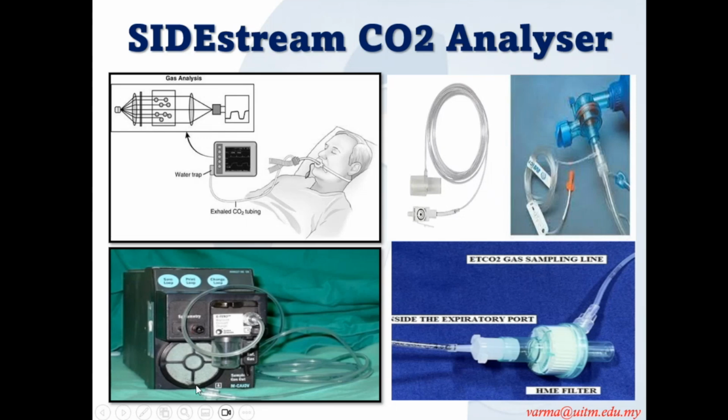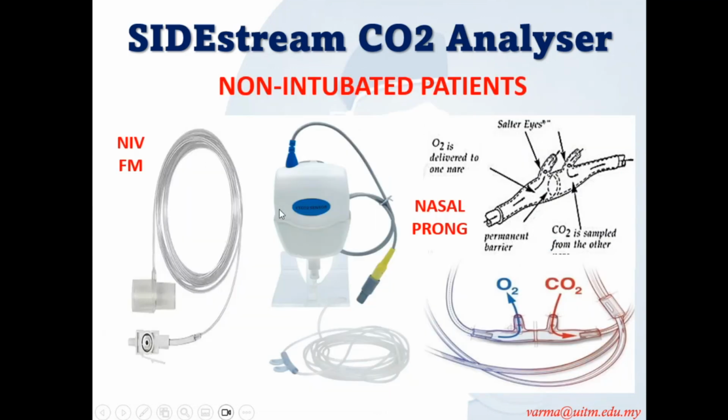Sometimes it doesn't read. The nurses will go and take it out and put a newer one, because it's been long. So the sampling tube sometimes also gets water vapor, blocked, or kinked. You have to change the sampling tube as well. So this is in an intubated patient. In a non-intubated patient, we can use the same one like this. As I said, can use in Ventimask, NIV and everything.